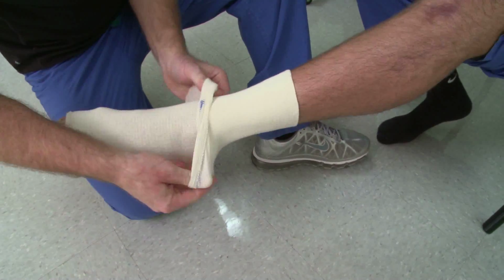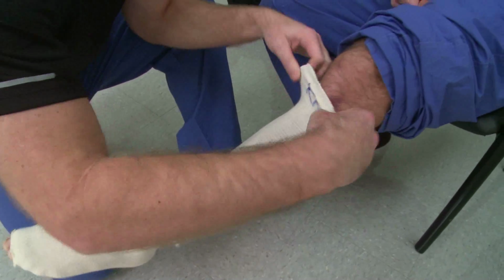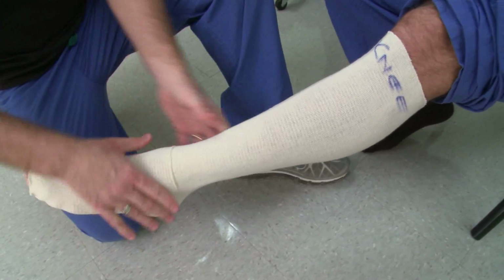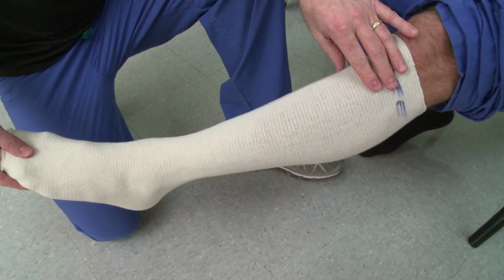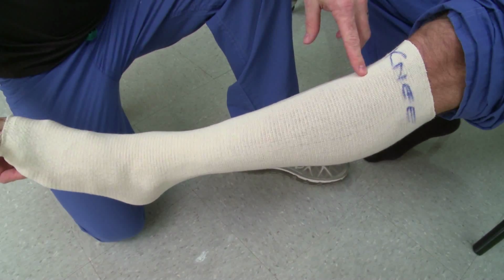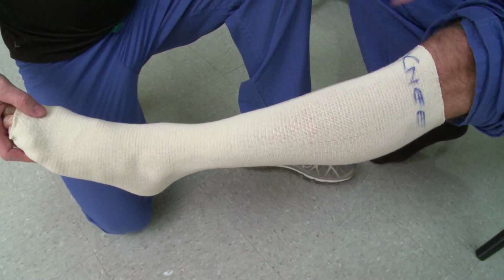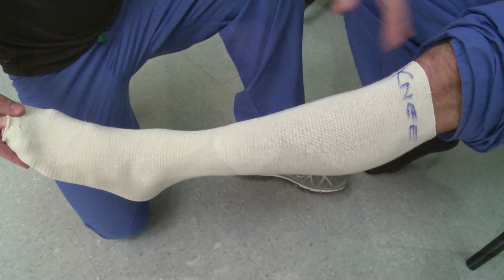I'll now unfold that other layer and gently place right to the knee down to the toes, smoothing all areas to prevent any extra compression. This is a way to have the most pressure here, middle pressure here, and no pressure here to help reduce swelling in the entire leg.